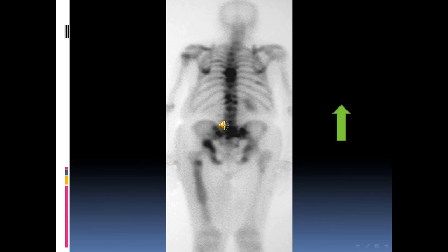Isotope scan is one of the most important imaging modalities that can help us. As you can see in this isotope image, there is abnormal uptake in the thoracic vertebral body and in both iliac bones, especially the right one, and even part of the femur. This patient may have a metastasis from a primary elsewhere in the body.